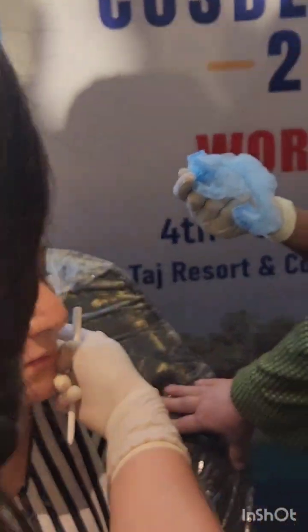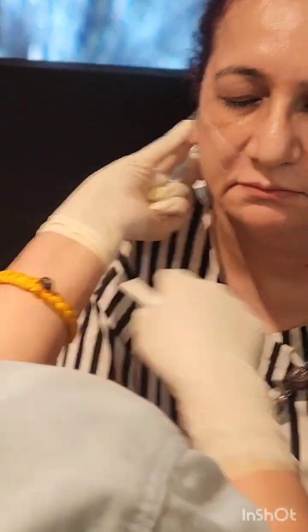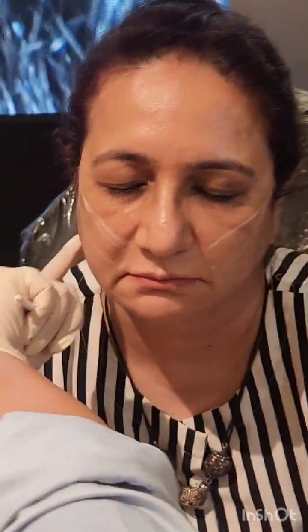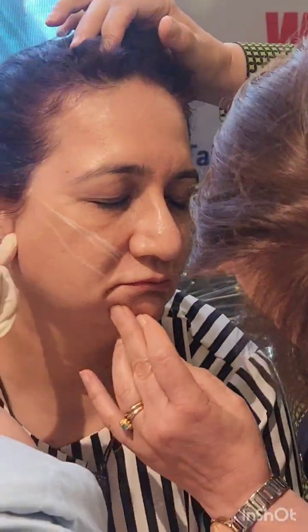Correct. Now here we are targeting the platysmal auricular fascia, right? For the entry, you can go right from the earlobe, or you can come from here, ahead of the tragus, wherever we want. Ma'am, please don't move.